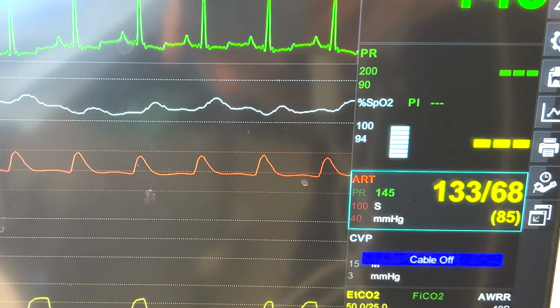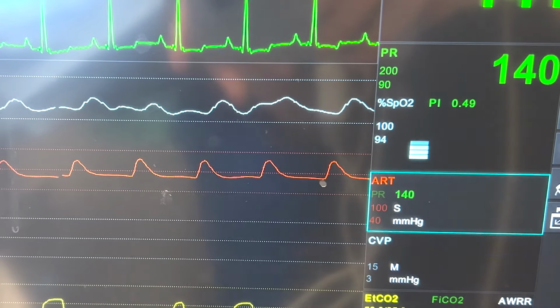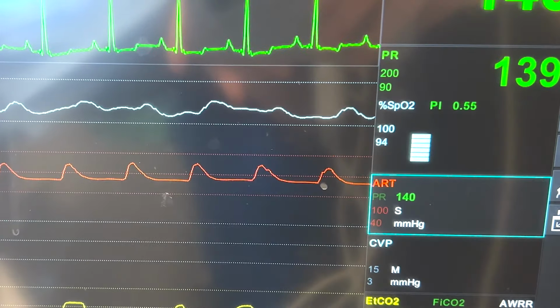In addition, if you have a pulse ox on a thin area of tissue, the pulse oximeter probe is going to apply pressure to those capillary beds, and over time you'll see your pulse ox will drop as those capillary beds have too much pressure on them and are no longer refilling as they should be. So you often need to adjust where your pulse oximeter probe is if you're monitoring a pulse oximeter for an extended period of time. Some studies have shown that if you put a wet, moist gauze in between the tissue and the pulse oximeter probe, you can increase your pulse oximeter's accuracy.